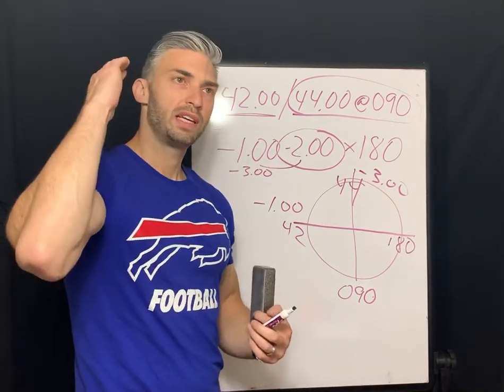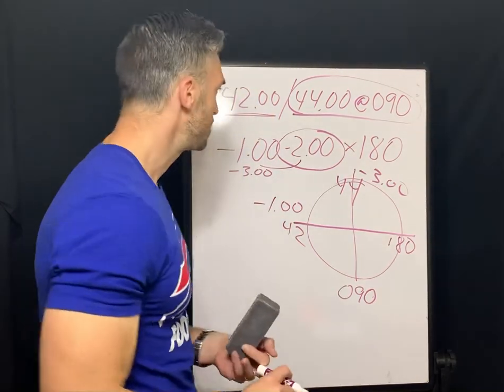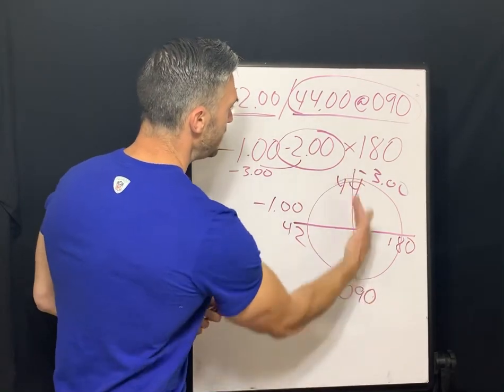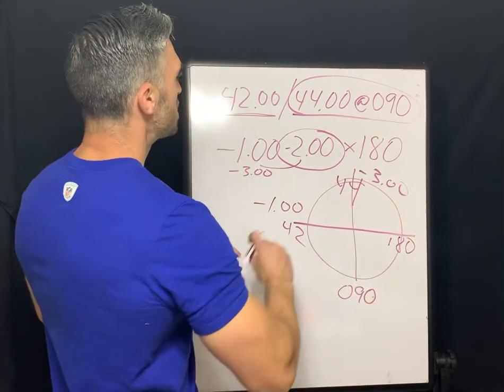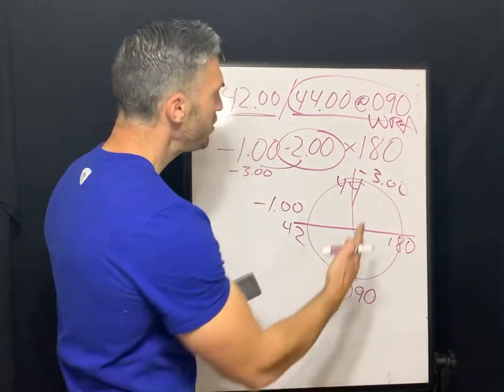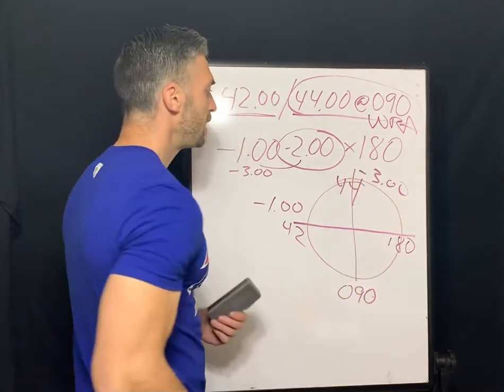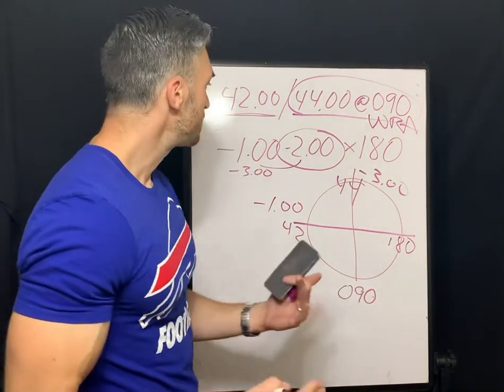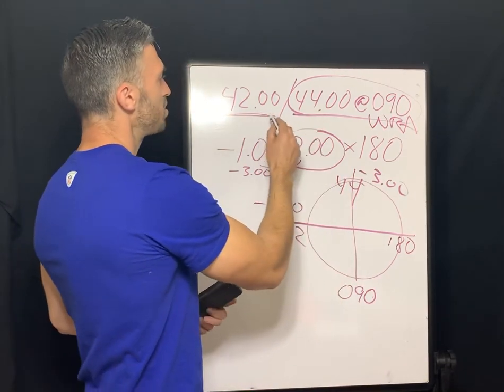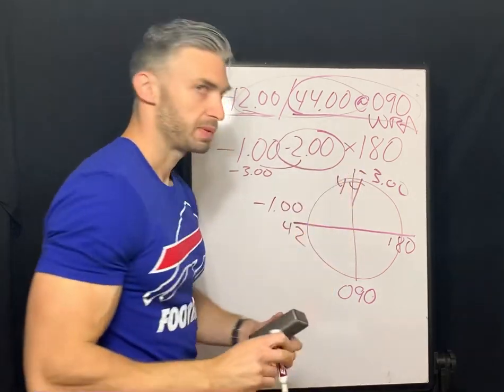Think of it as convex, not concave like a minus power lens. Because the cornea is steeper in the 90 degree meridian, with the rule of astigmatism, you need more minus power in that meridian to neutralize that astigmatism. So I digress. It's 2 diopters of corneal astigmatism, 2 diopters of refractive astigmatism.